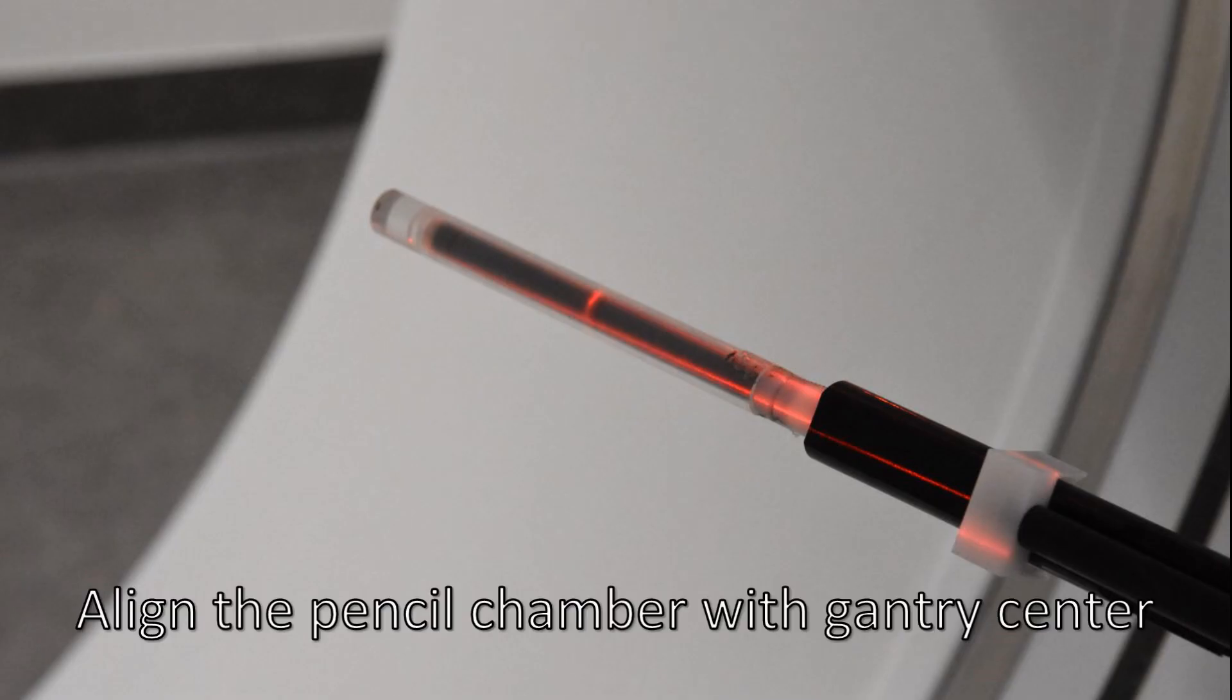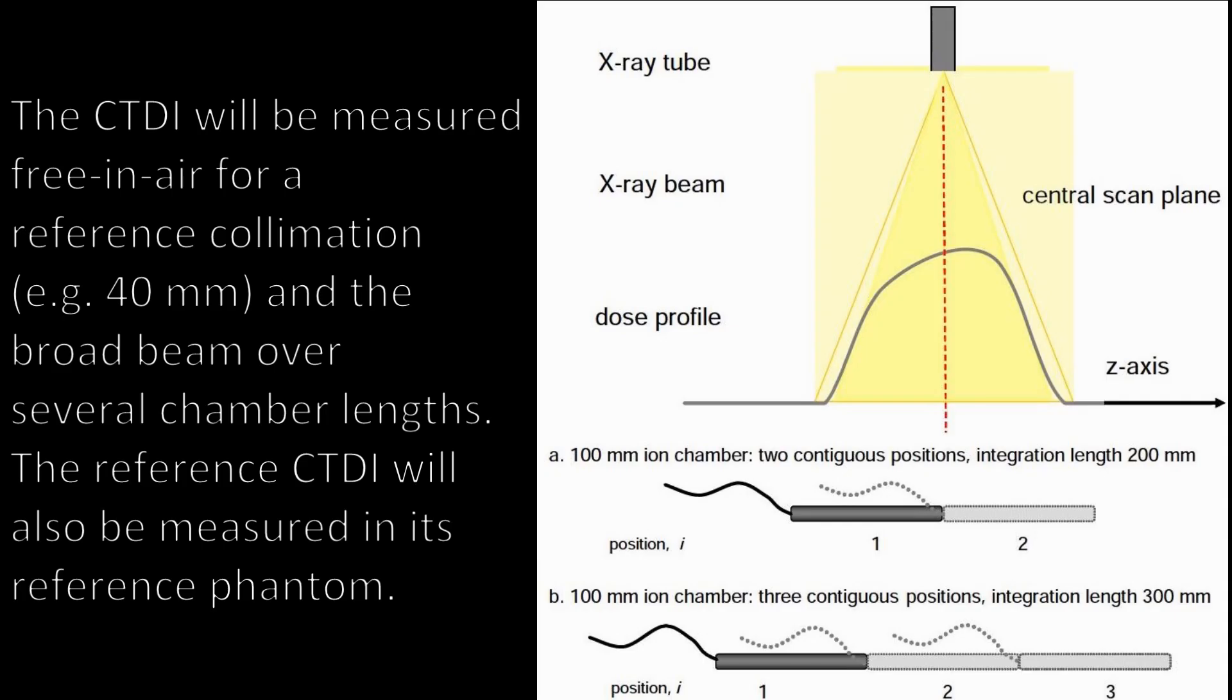Align the pencil chamber with gantry center. The CTDI will be measured free in air for a reference collimation, for example 40 mm, and the broad beam over several chamber lengths. The reference CTDI will also be measured in its reference phantom.